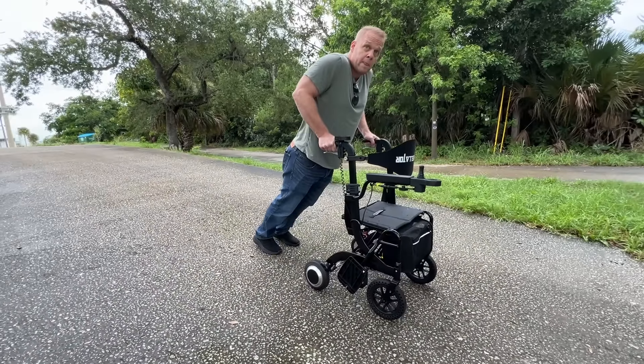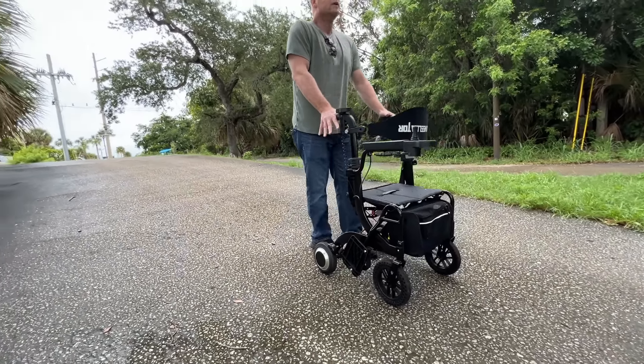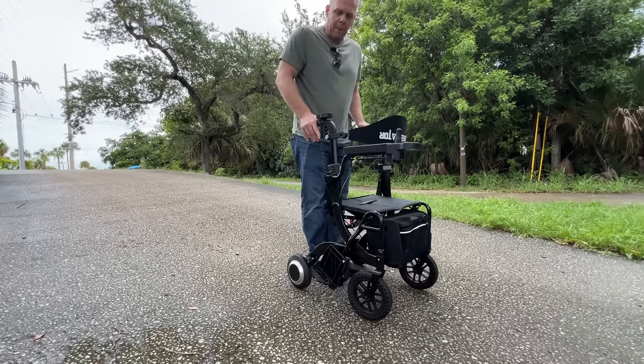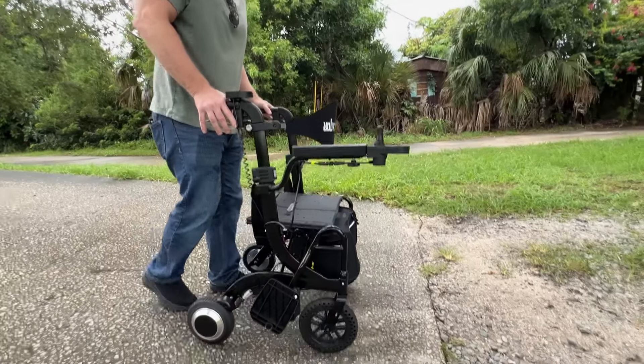And if I do slip and fall, it locks. I'm pushing my weight down on the device, getting myself back up, and it's going to display the 0-1 all over again. So it has some great safety features.